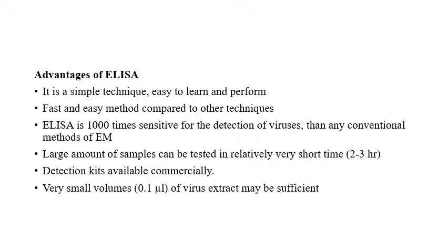Now let us see some of the advantages of ELISA. It is a very simple technique, easy to perform, and a very fast method compared to other techniques. The sensitivity, as I told you, is 1,000 times more than any other serological and other techniques employed in plant virology.